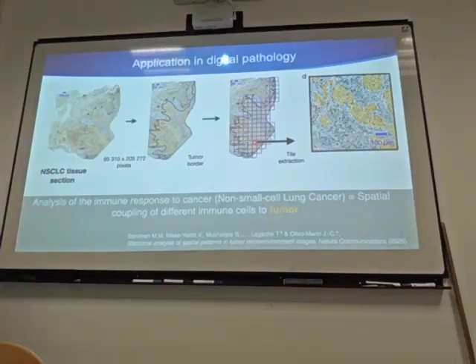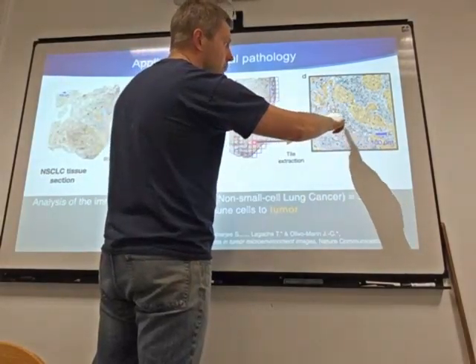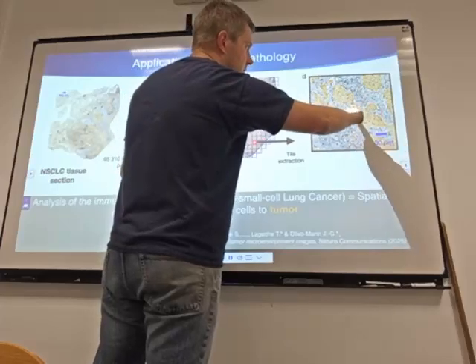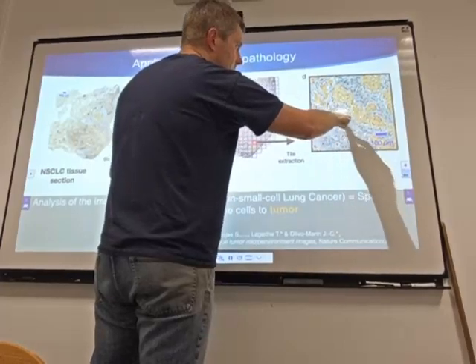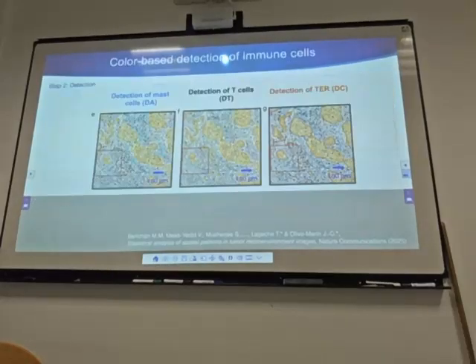We looked at the distribution of the different immune cells in cyan and around the contour of the tumor. So here you need really to get a level set mapping of this, in between cells. And so there is a first step where you detect cells. So here it's not easy.